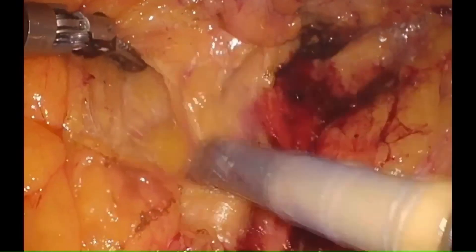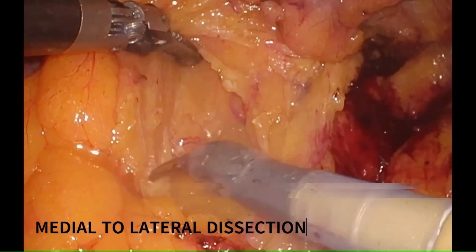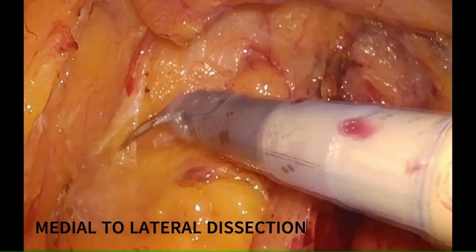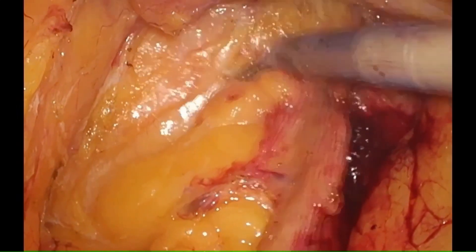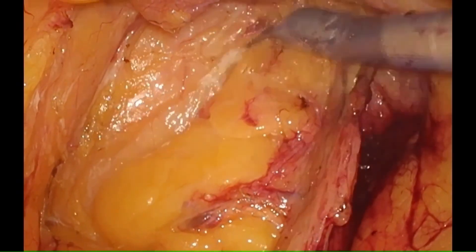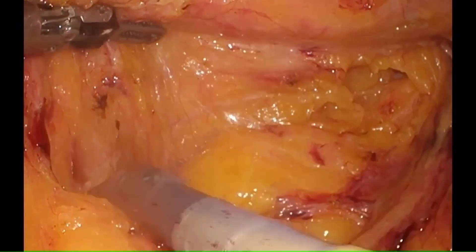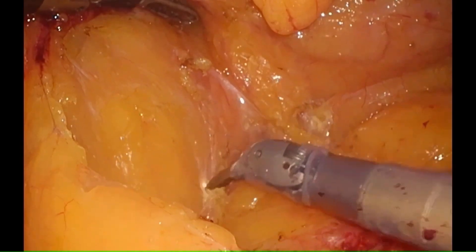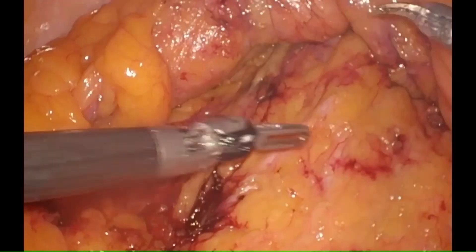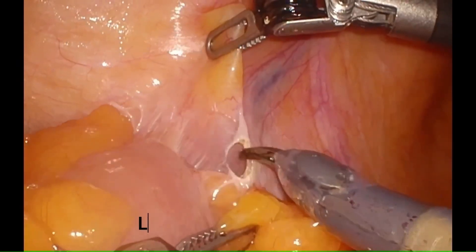After division of the vessels, we continue to do medial to lateral dissection, finding the correct plane between Gerota's fat and the colonic fat. As we continue the medial to lateral dissection, we identify the three tubular structures: the left common iliac artery, the ureter, and the gonadal vessels. This marks the end of our medial to lateral dissection.